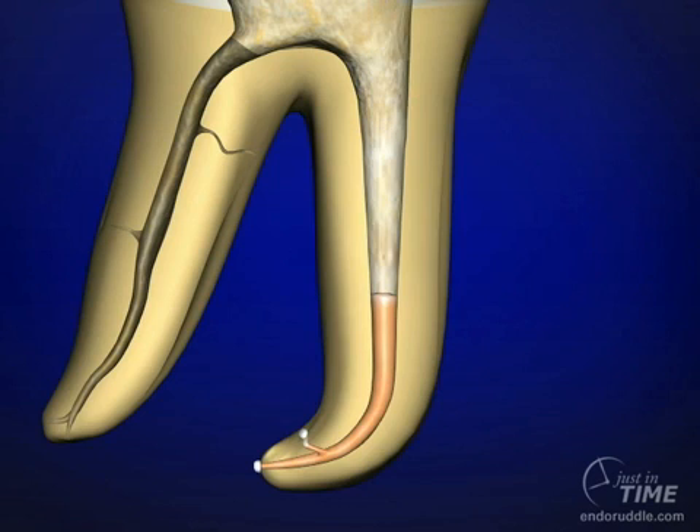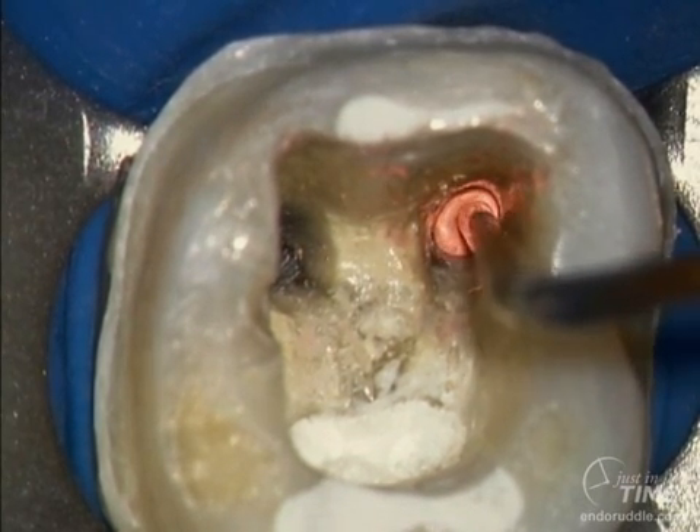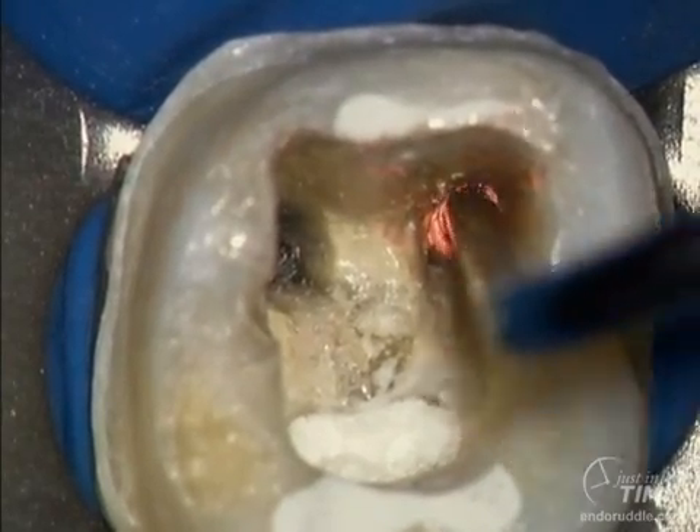The Calamus Flow cannula comes in, re-thermally softens the coronalmost aspect of the previously established gutta percha, and again we syringe in perhaps 4 or 5mm of thermosoftened gutta percha. Use the pluggers methodically and deliberately to mold and adapt the gutta percha. Always condense cooling gutta percha to offset shrinkage. The backpack can continue to any level of the canal desired, with an eye towards restorative dentistry. I usually bring the backpack up just below the orifice, and leave the gutta percha about 1 or 2mm sub-orifice.